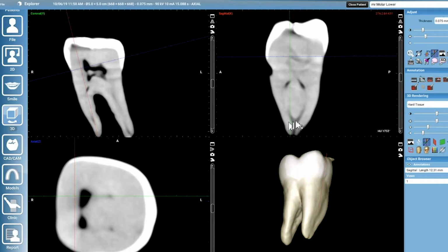The confluence here, the joining of the lingual and the buccal, isn't too dynamic a curve, so we slid down there, got working length relatively easily.